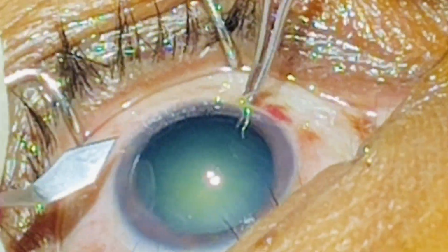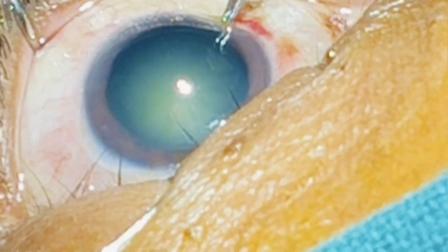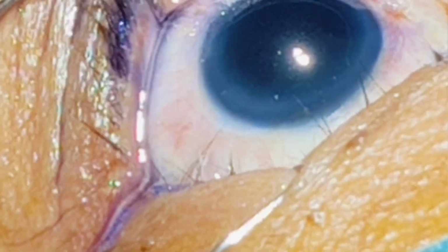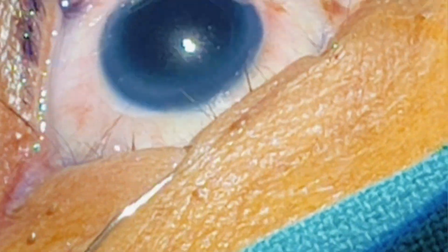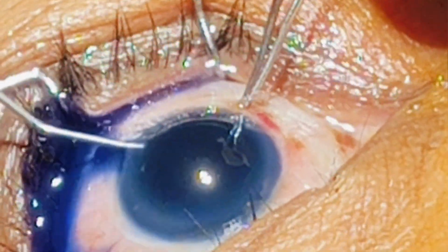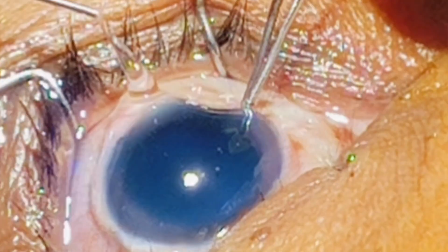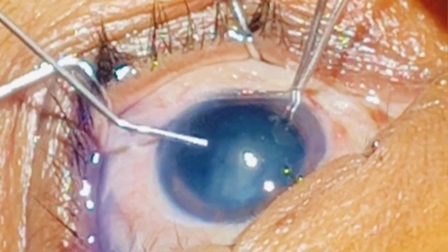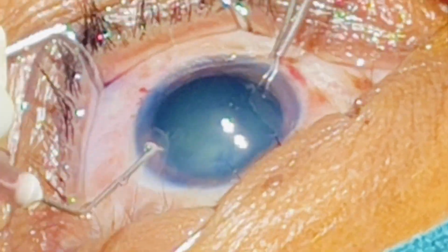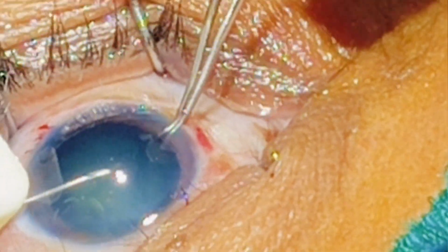So this is the topical phacoemulsification case of NS3 cataract. I made the first side port incision, and with trypan blue dye we are staining the anterior capsule. Now we'll wash out the trypan blue dye, and I'm injecting viscoelastic substance into the AC and placed a bit of the visco over the cornea so that I can have a clear view.